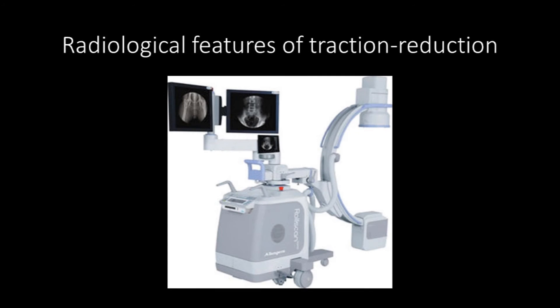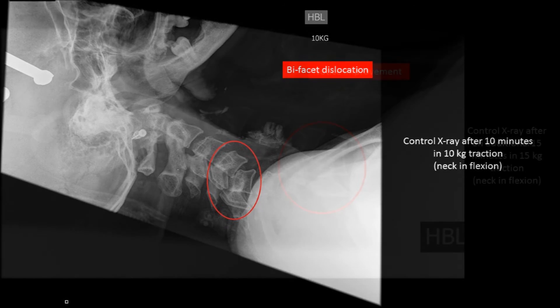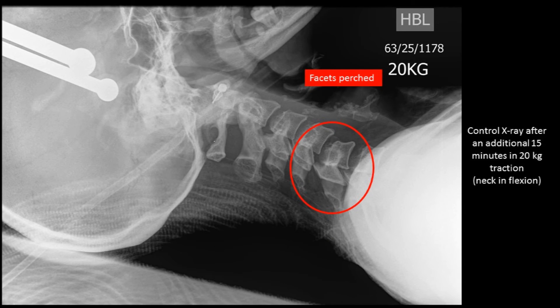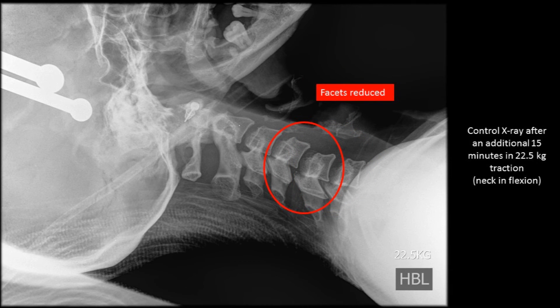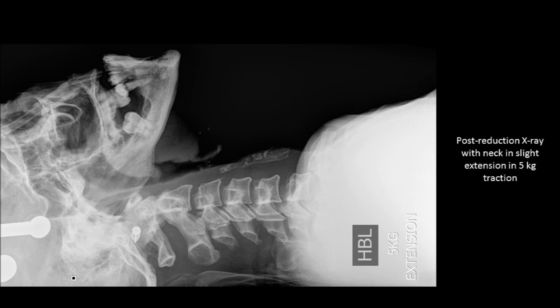The radiological features of traction reduction in a patient with bifacet dislocation are now shown. A control x-ray after 10 minutes at 10 kilograms traction with the neck in flexion is presented. Traction was increased by 5 kilograms, and an additional 5 kilograms was added. Facet reduction was achieved at a total weight of 22.5 kilograms. The post-reduction x-ray shows the neck in slight extension with 5 kilograms traction. It is important that traction is continuously maintained when the patient is transferred to the ward and during hospital stay.